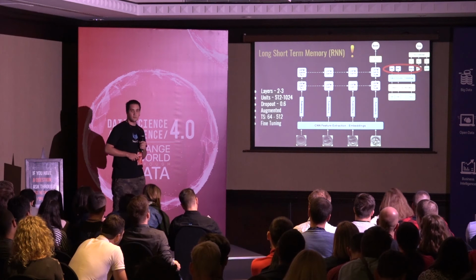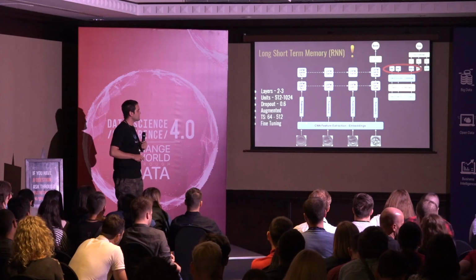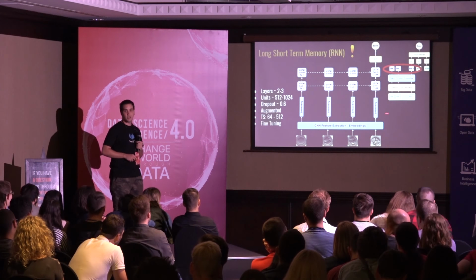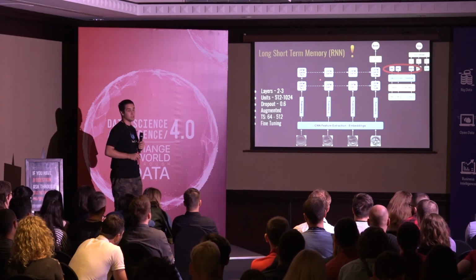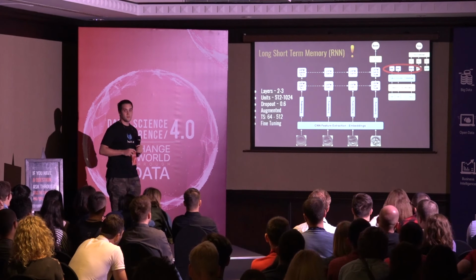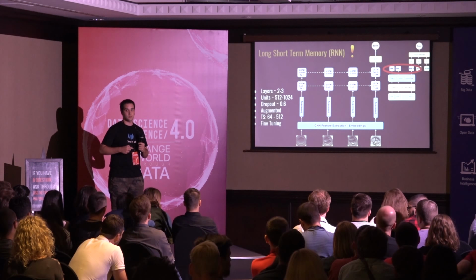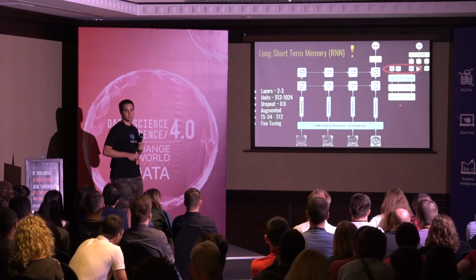And one good thing is that this feature extraction is frozen. So at training time, it won't train. It trains only this LSTM network. But with a much bigger data set and much more resources, we can unfreeze this feature extraction.